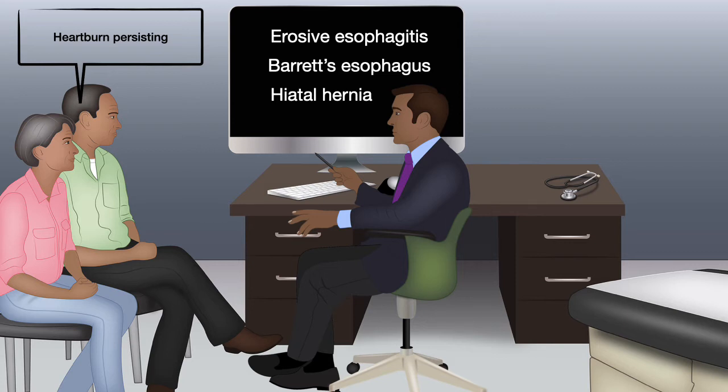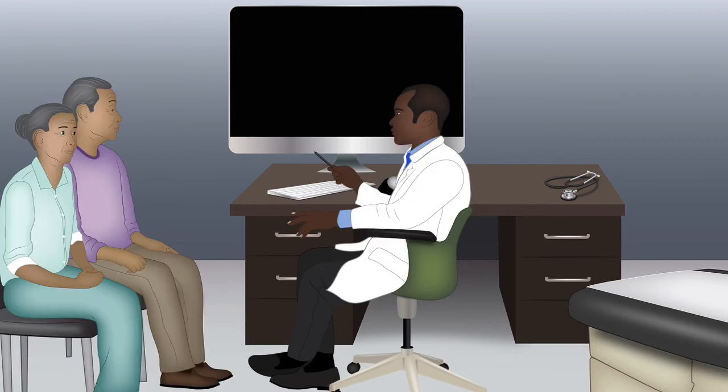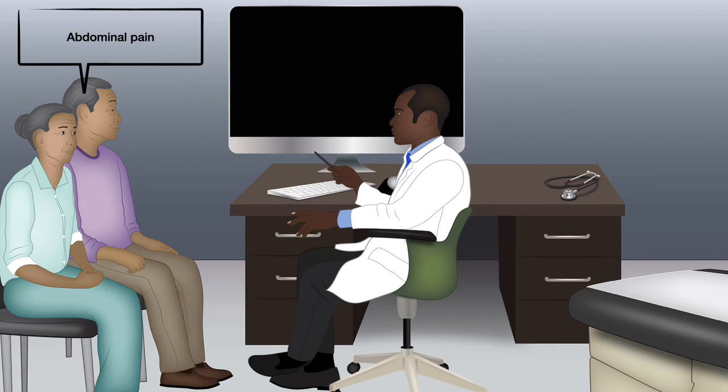So next, let us look at another patient who comes in with abdominal pain. He has taken some antacids, maybe famotidine over the counter, but the abdominal pain persists. In this patient, when you do endoscopy, you are looking for gastritis, that is inflammation of the lining of the stomach.